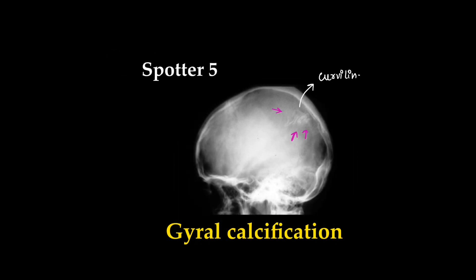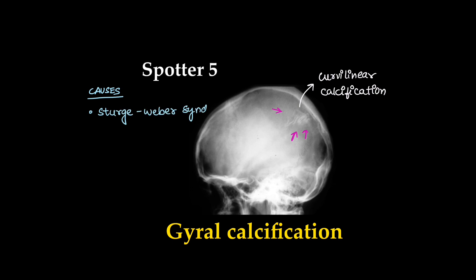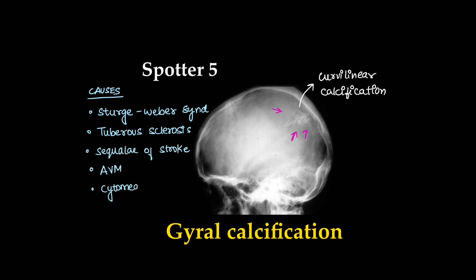Here we can see a curvilinear calcification. This is gyral calcification or gyriform calcification. Multiple causes include Sturge-Weber syndrome, tuberous sclerosis, sequelae to ischemic stroke, arteriovenous malformation, and infections like cytomegalovirus and toxoplasmosis.